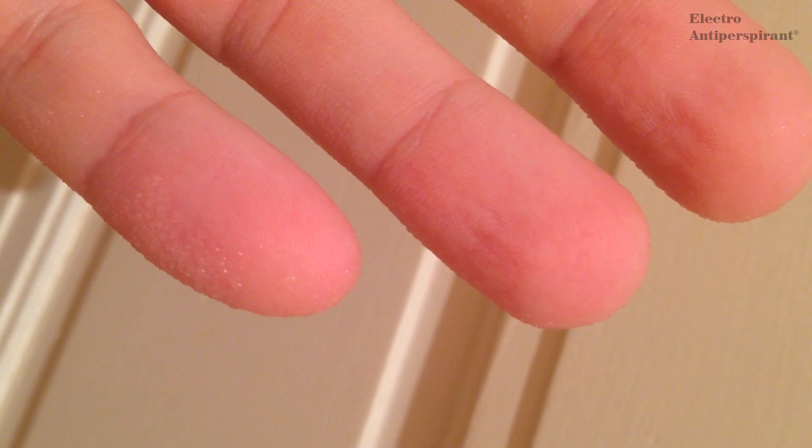Now it's dry. Do you see it? Slow, but this is hyperhidrosis — sweating again and again, every day.